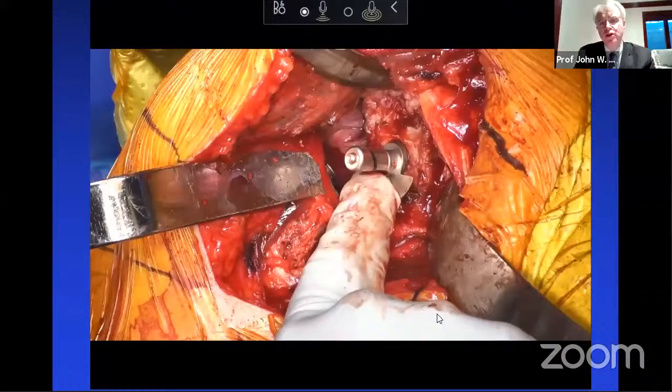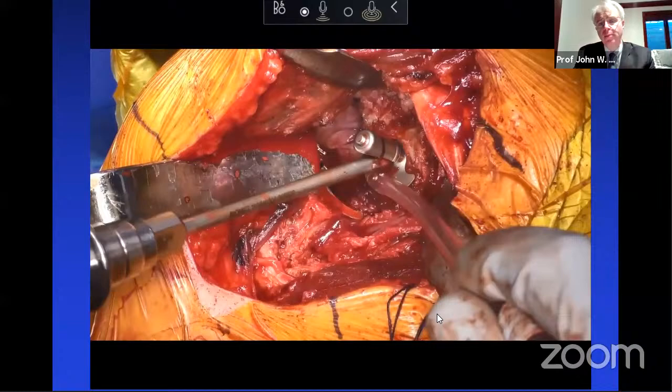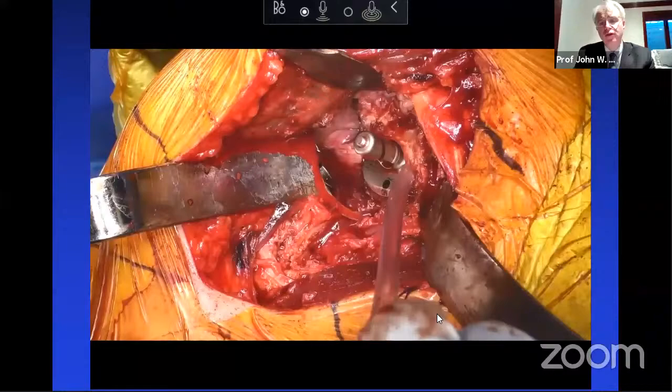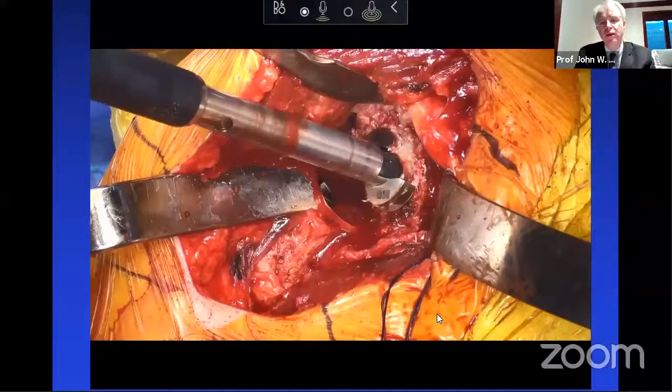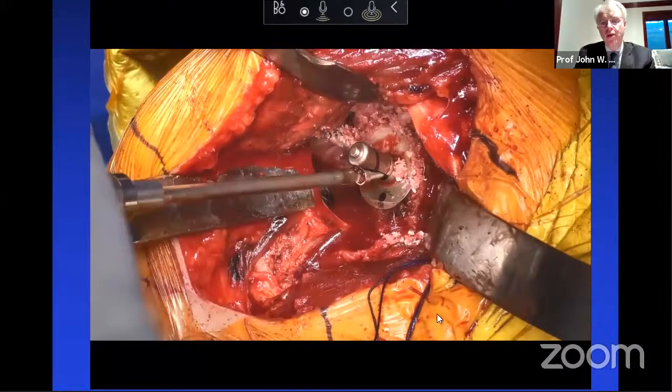So we'll go ahead and place a guide on the bone. Once that guide is flush with the bone, we'll stop turning the screwdriver. We're flush like that. We'll put a black cap on there, and then we'll be able to go ahead and ream the glenoid. I love that bent Hohmann above. I learned that during one of my traveling fellowships. That can really help give you a nice view of the superior part of the glenoid. You'll see we'll preserve that hard cortical bone on the upper part of the glenoid itself.